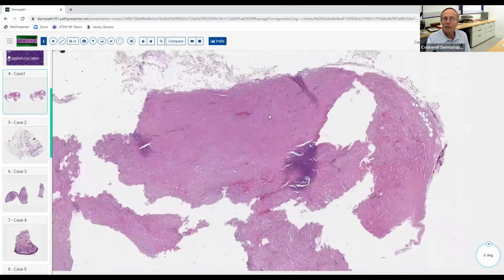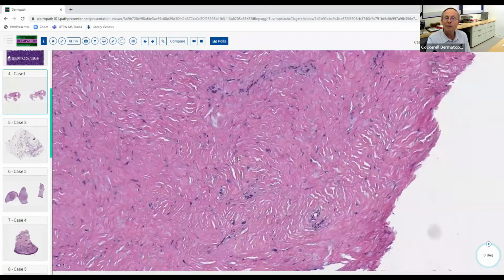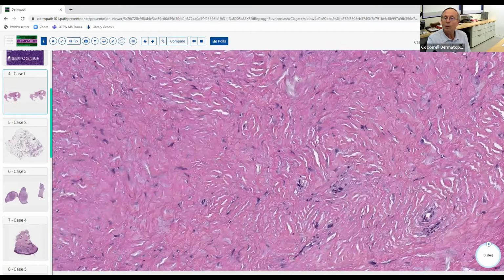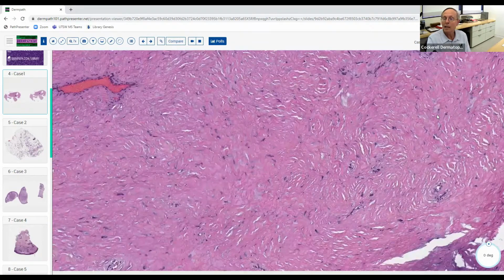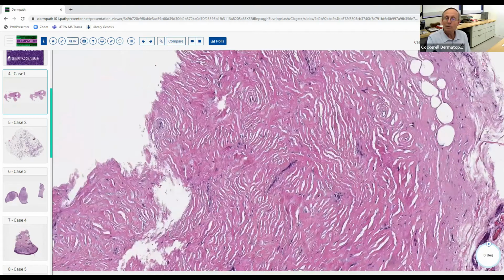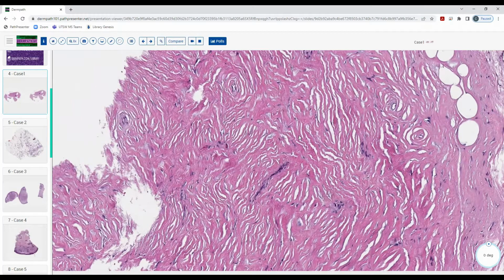And if it's a neoplasm, it's more likely to be non-epithelial, because you mentioned it had a fibrotic or sclerotic collagenous stroma to it. And I agree with that. And these are fibroblasts in here that you can see, and they're not really atypical. There's really no mitoses. There's no striking atypicality or any of those things that you described. Is there anything that this area here brings to mind? It kind of reminded me of PASH or something from breast, but we don't do breast in dermatopathology. So. Yeah.